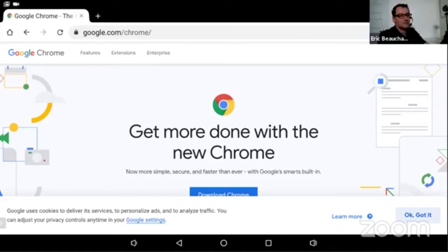Yeah, so as you can see, it's quite a few more steps. And if you have TalkBack activated, then you would have to scroll on each app that's in the list that Natalie was just showing you. But if you go straight from Prodigy, you have that big, nice icon on the screen, and you see exactly that it's the Chrome application. So thank you, Natalie, for that.